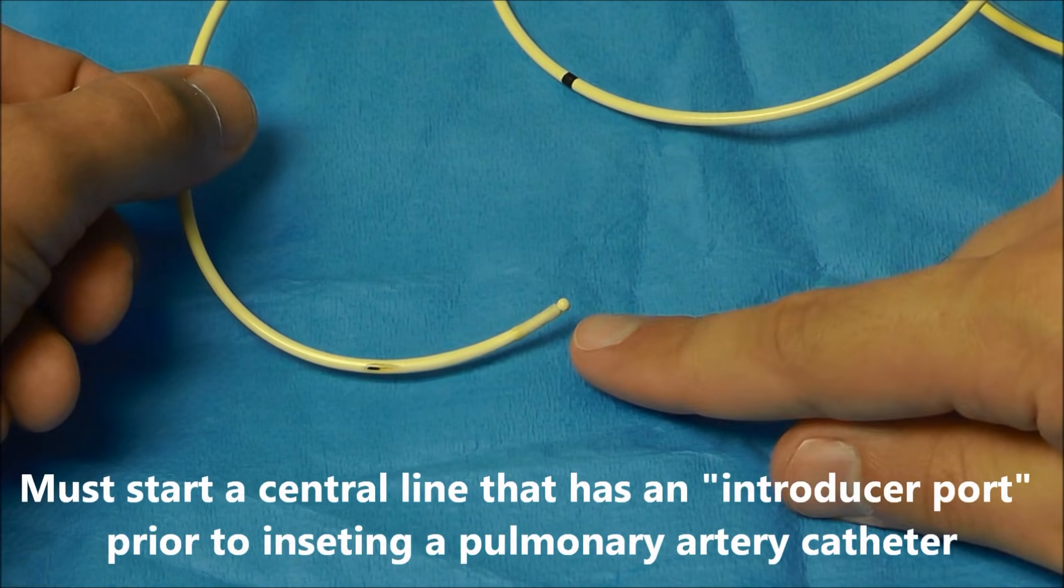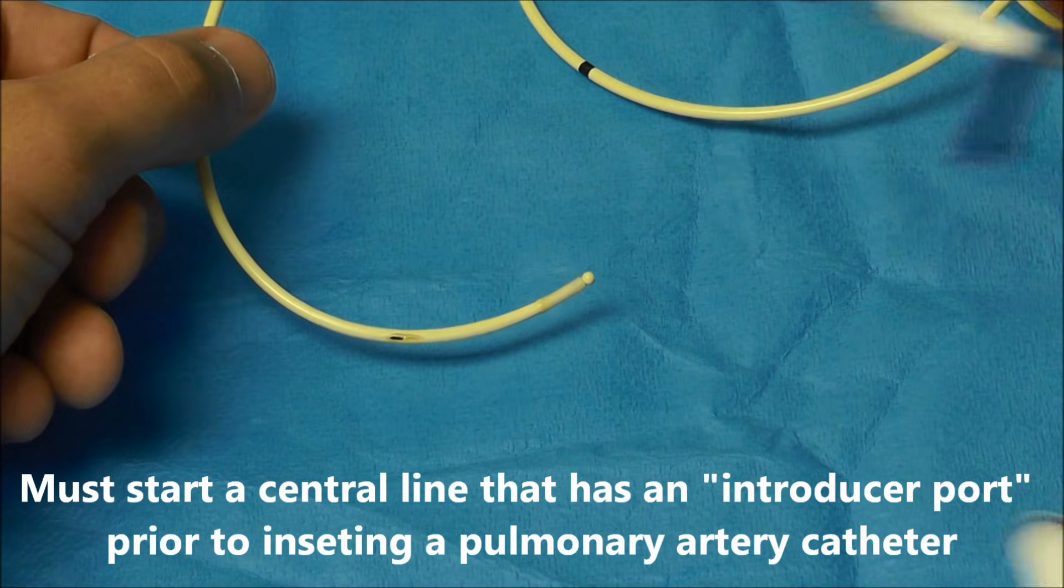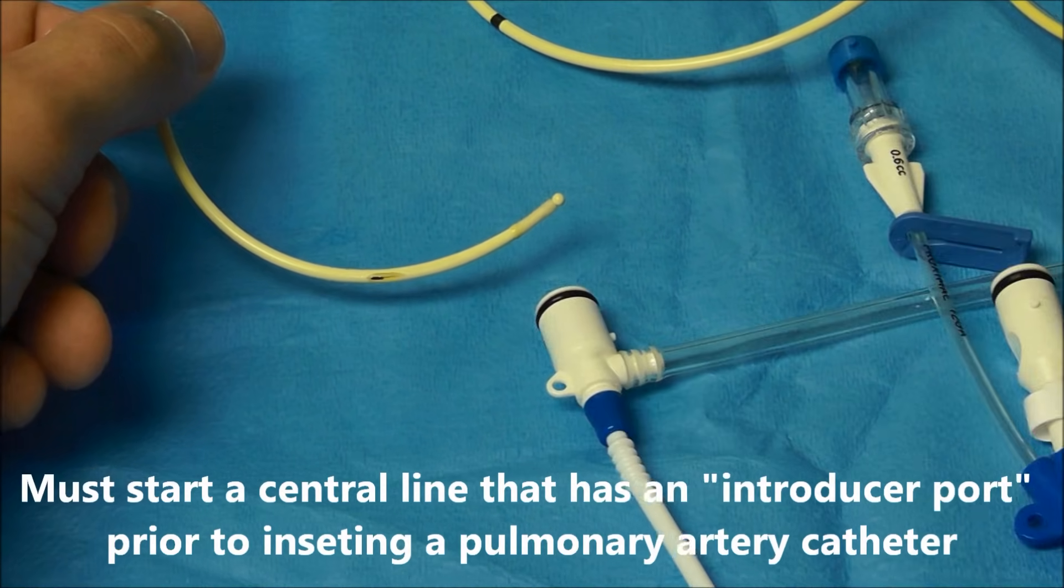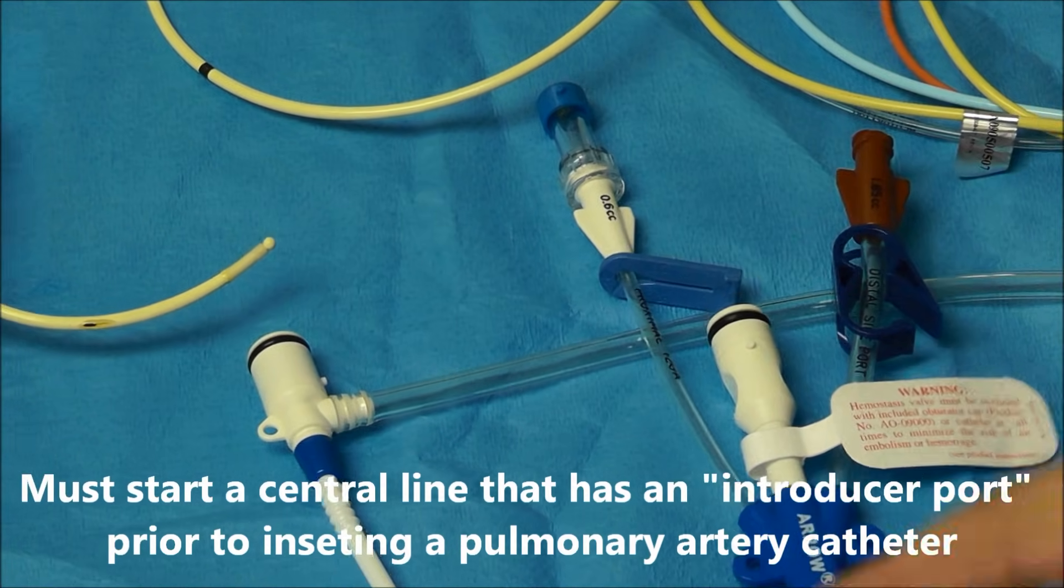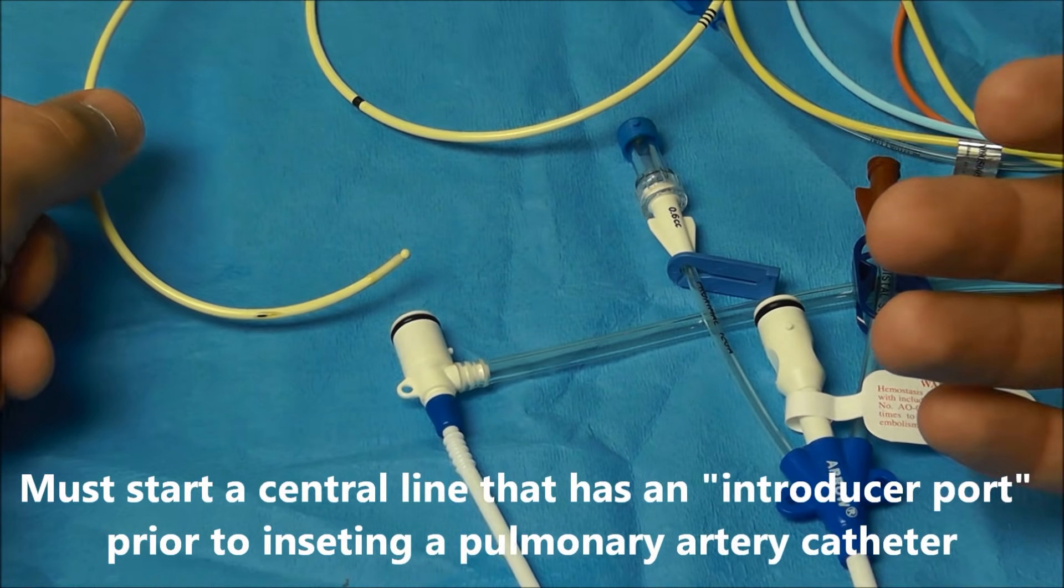In order to get this into a pulmonary artery, you have to start a central line with a central catheter that has an introducer port, and then you're going to insert the Swan through the introducer port and guide it into the pulmonary artery.